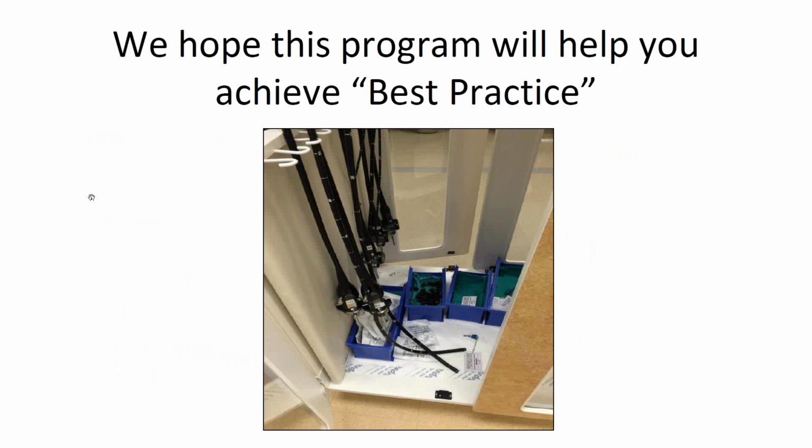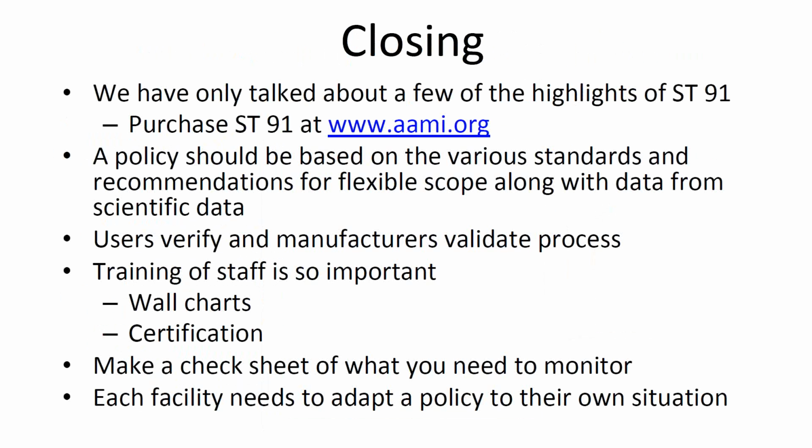So if you go to the last slide, please. We've only given you the highlights of ST91. It is over 200 and some pages. If you haven't bought ST91, go to www.aami.org. Also, remember, a policy should be based on the various standards and recommendations for flexible scopes along with scientific data. Remember, users verify, manufacturers validate the process.